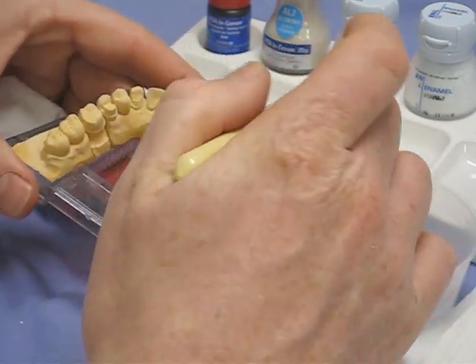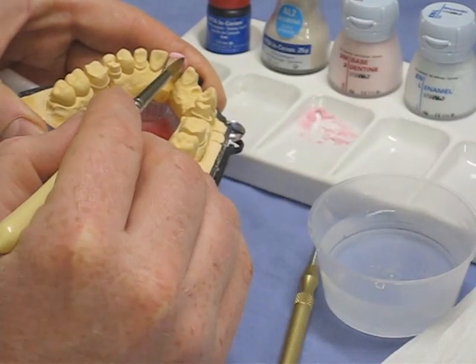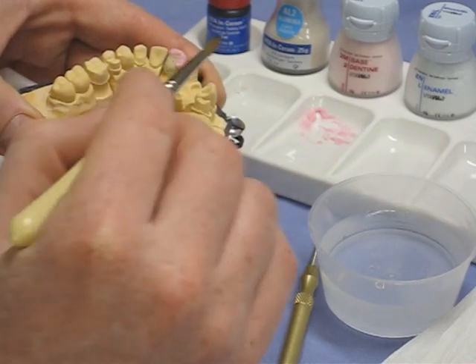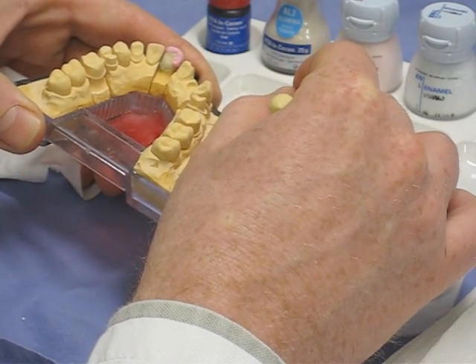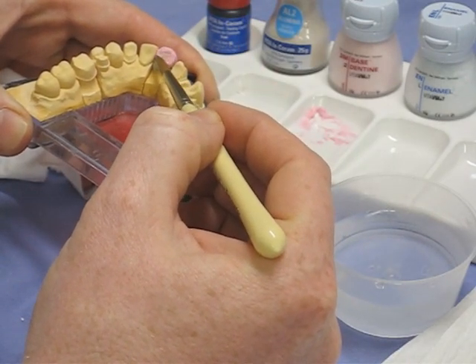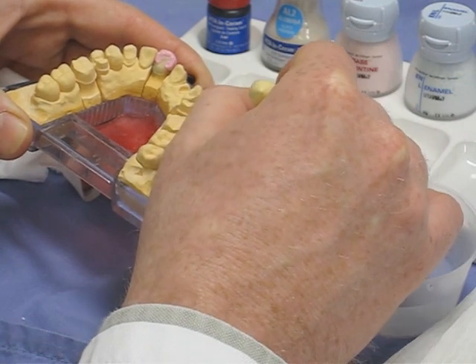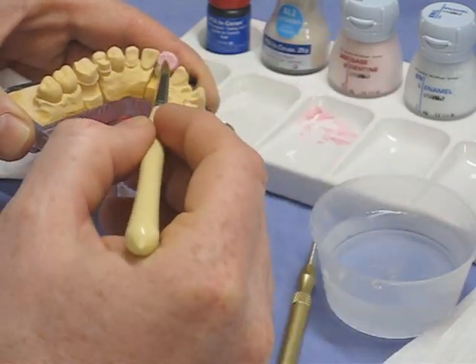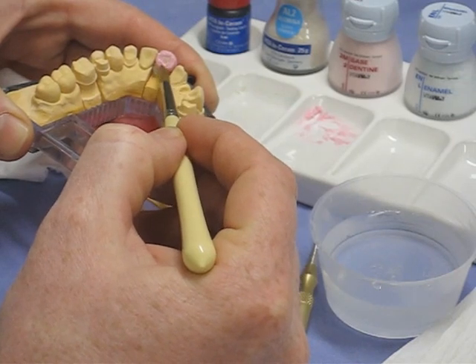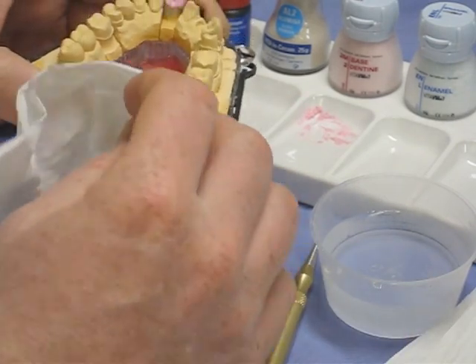With this most basic technique, we use just the base dentine to build up to full contour. We'll then cut back and apply some enamel shade at the incisal edge, and try to create some mamelons in the labial surface for a little bit of detail. When you look at a ceramics kit, you'll see a whole range of ceramics varying in translucency and colour — you can place different ceramics around the margin and use internal colours to create enamel cracks and so on.